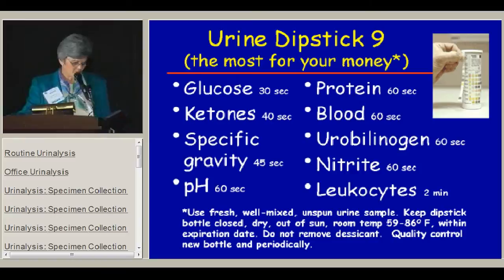To get accurate and useful information from the dipstick, you need to use a fresh, well-mixed, unspun urine sample. The dipstick bottle should be kept closed, dry, out of the sun, and at a reasonable room temperature. It should be used within its expiration date. It's very important not to remove the desiccant from the bottle or the dipstick pads will lose their accuracy. You need to do quality control with a new bottle and periodically thereafter.